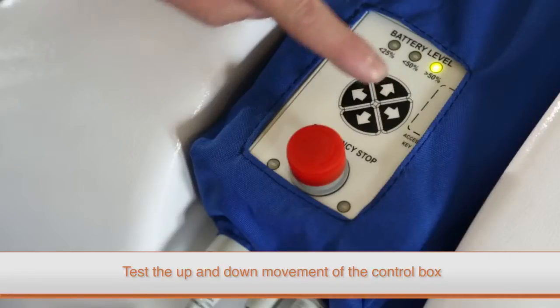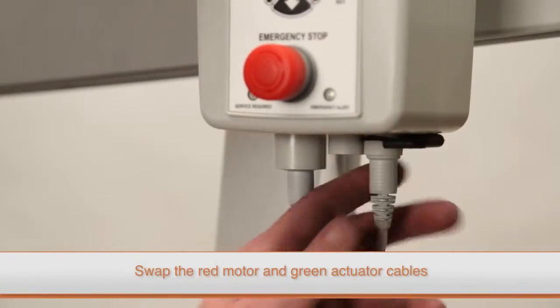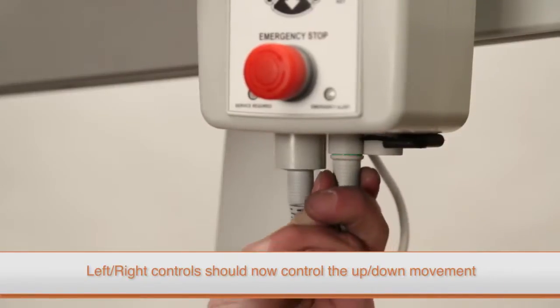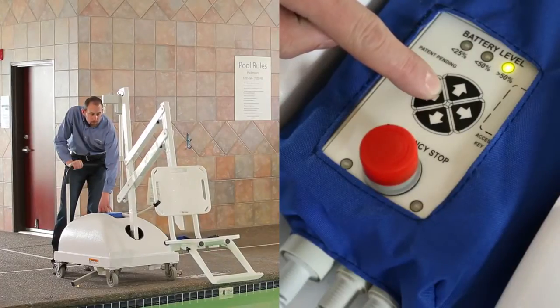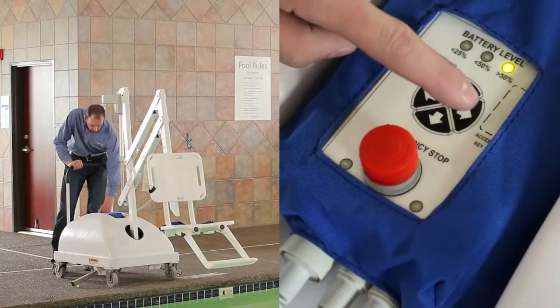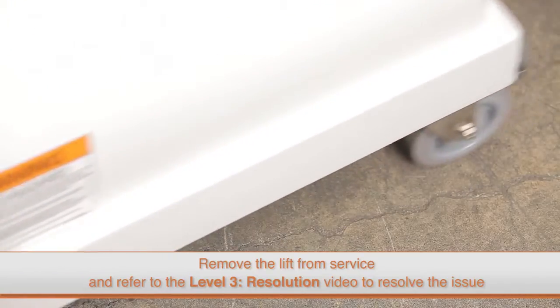When testing the control box, you'll want to specifically check the buttons that control the up and down movement. To do this, switch the red motor cable and the green actuator cable. By doing this, the left and right buttons on your control box should now control the up and down movement of the lift. After switching the cables, if the lift moves up and down by pressing the left and right buttons, you know the up and down buttons on the control box are not functioning properly.